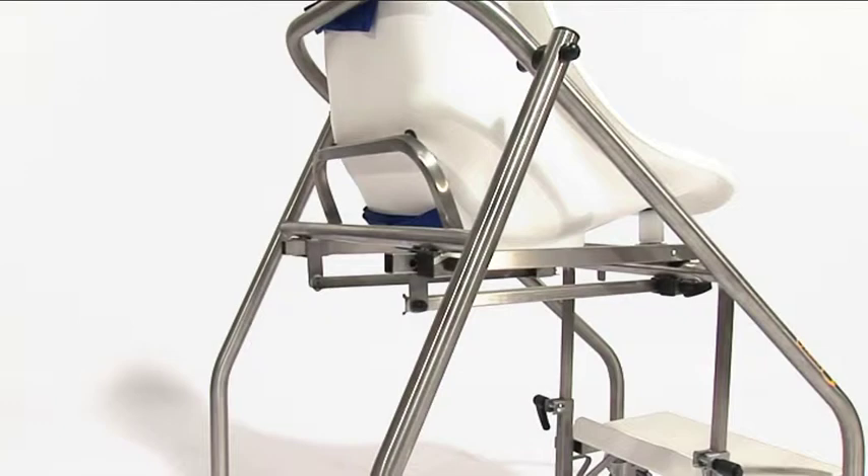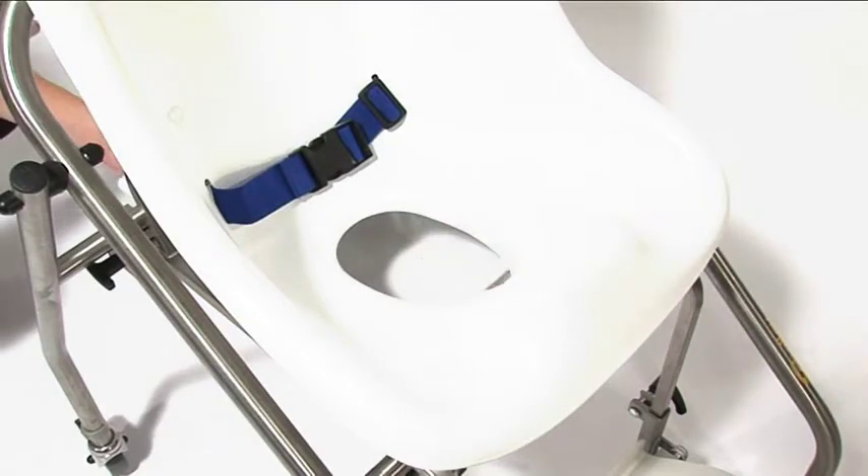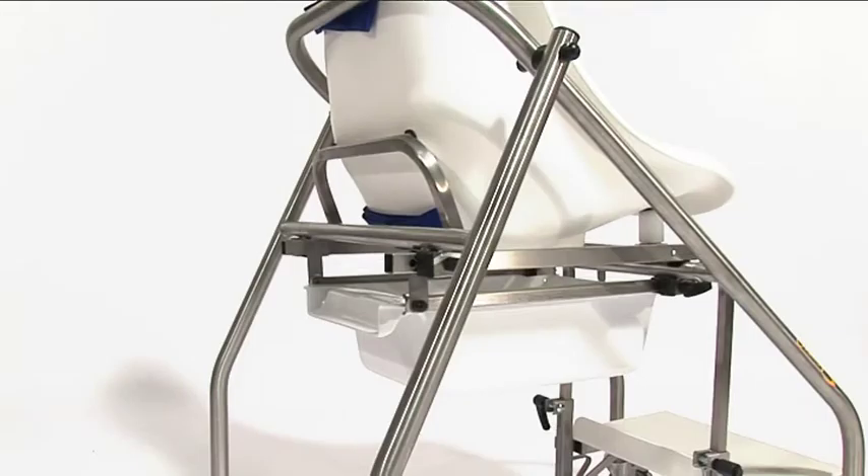The potty accessory slides underneath the moulded seat from the back, using the stainless steel channels. Slide the potty as far forward as it will go to ensure that it lines up with the aperture in the moulded seat.